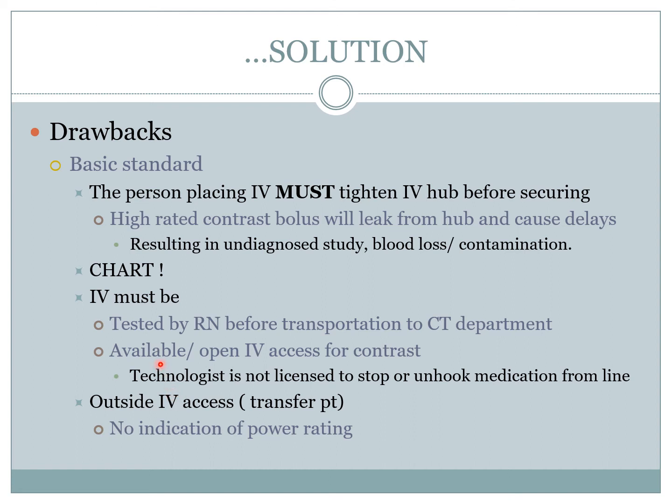And then sometimes the patient comes down to the CT department with medication running, blood running, and they only have that one access, and there is no available IV for the contrast. The CT technologist is not allowed and not licensed to pause the medication.